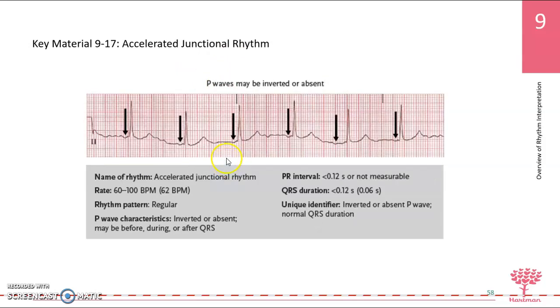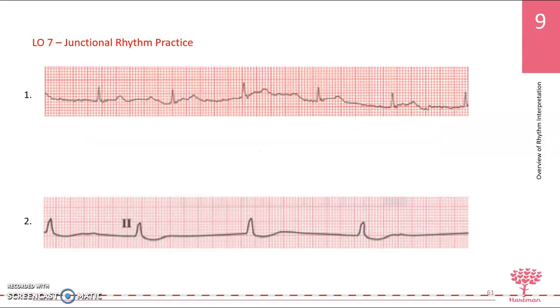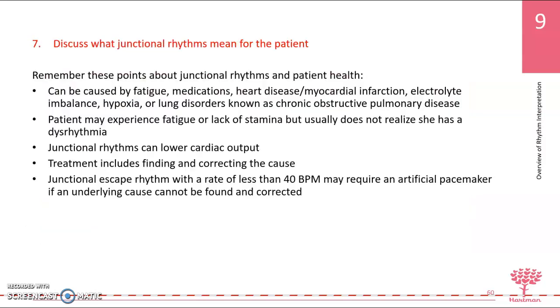Again, I'm going to go through some of these fairly quickly because you can look at these yourself and review them. I've also given you flashcards in the Canvas module. I would suggest that you print those off and start flipping through them, reminding yourself of what these look like, and try to name them off yourself.